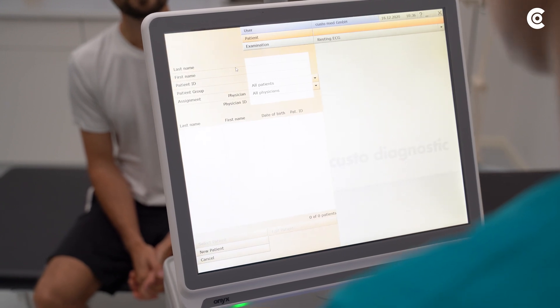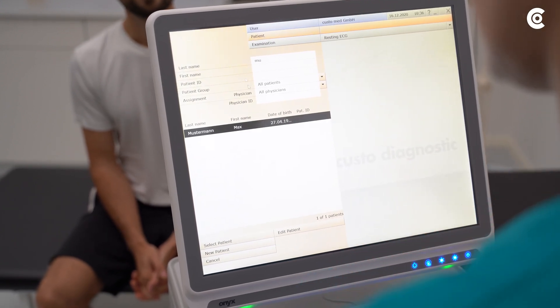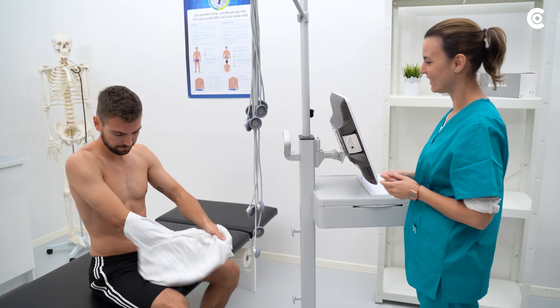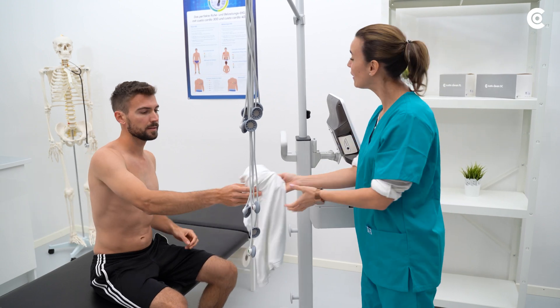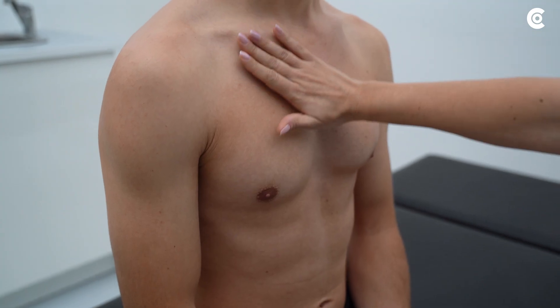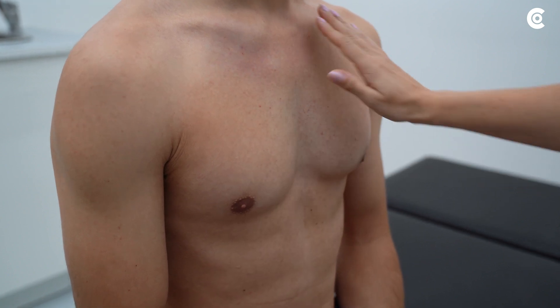First, create the patient data in CustoDiagnostic or import already existing data. Then prepare the patient for the measurement. If you work with the Cardio 300, make sure that there is no hair or any other residue on the spots where the electrodes will be placed.